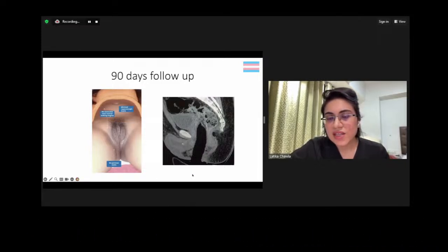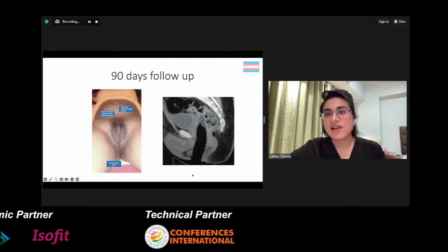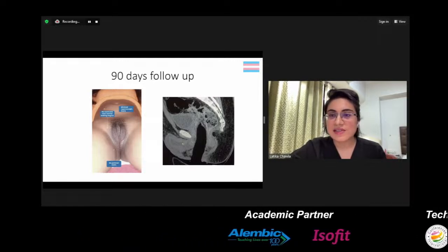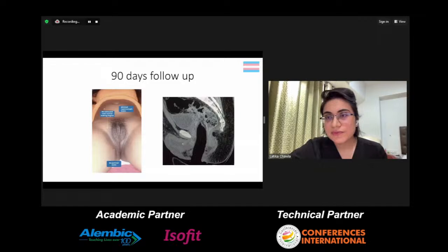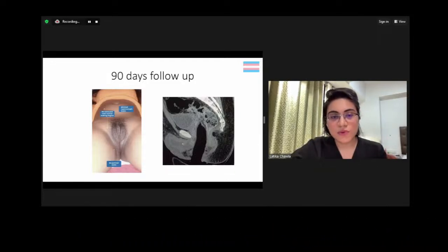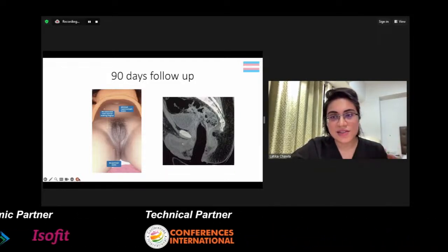Now, this was one of the IVPs we had done for one of our patients who had some urinary troubles, and we wanted to rule out any kind of thermal injury, which is why we have a film for that available. But this is the external view, the complete credit of which goes to the plastic surgeon team I operate with.